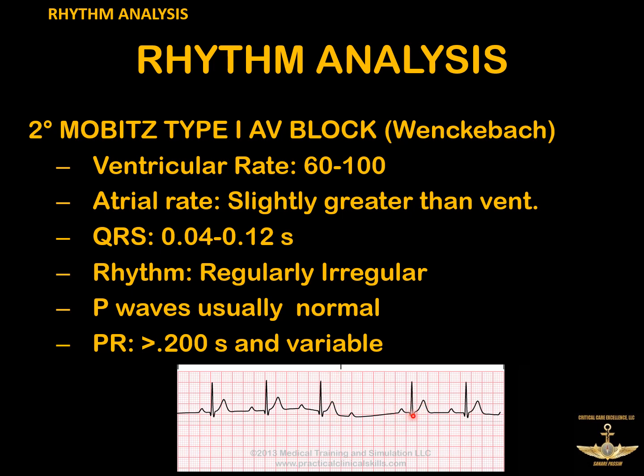That's why it's so important when you're evaluating these patients or when you're taking a test that you take plenty of time to look at these rhythm strips from beginning to end. Because if you were only to look at the first couple of beats right here, you may be inclined to say that was normal because the PR interval is not all that long. It's a little different, but maybe it's not that big a deal. Or if you only looked at these two, you may be inclined to call it just a first degree block because you didn't look at the whole thing.